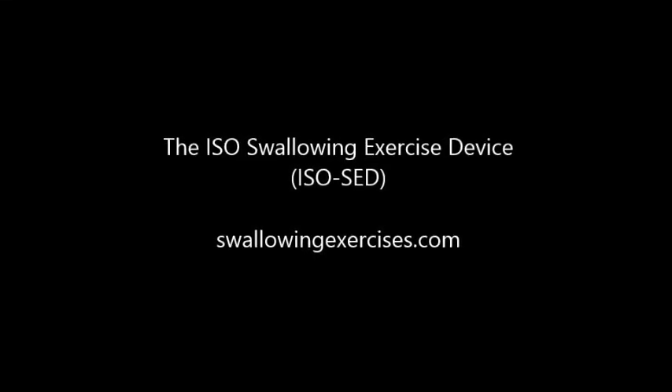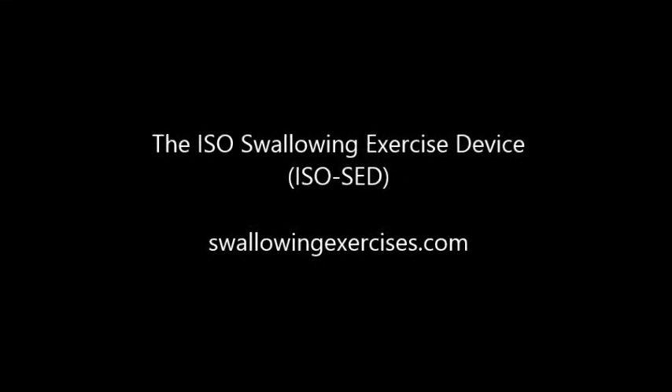The ISO swallowing exercise device was invented by a speech-language pathologist. It is designed to exercise the muscles of the throat that are responsible for swallowing.